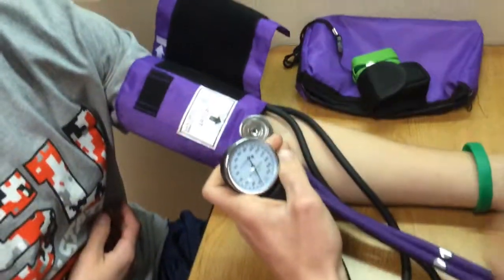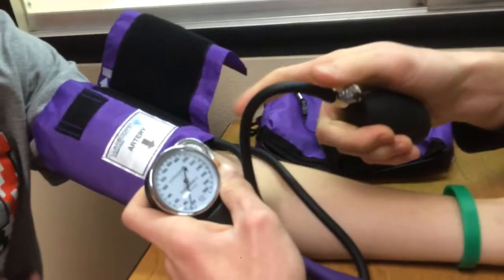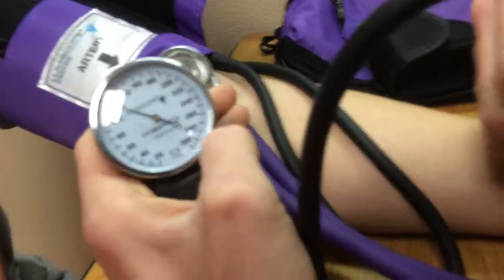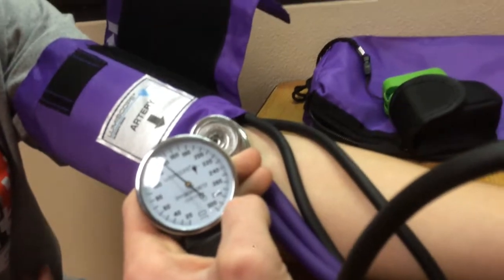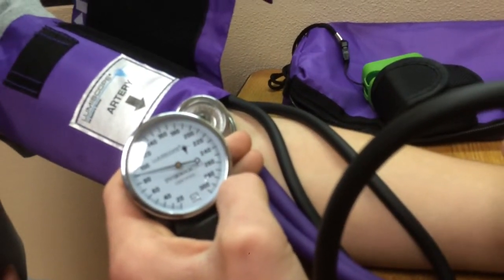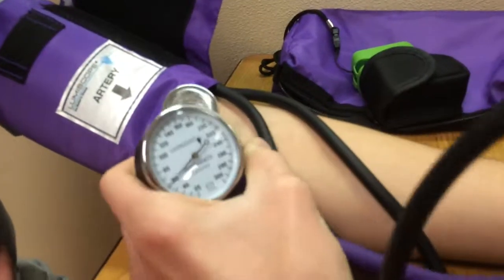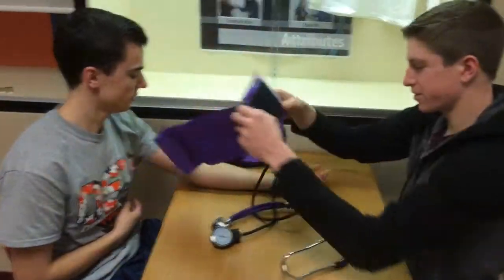Then you tighten the valve on this so it lets the air go into the cuff, and go up until about 150, and start letting it down slowly until you hear it. So his blood pressure was about 118 over 80, and then you take it off before he loses blood flow to his arm. That's it.